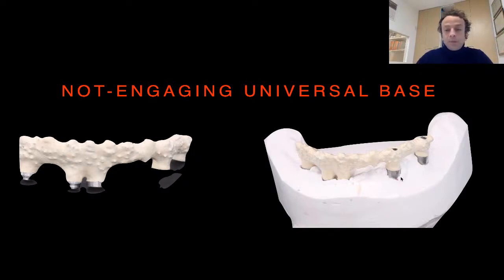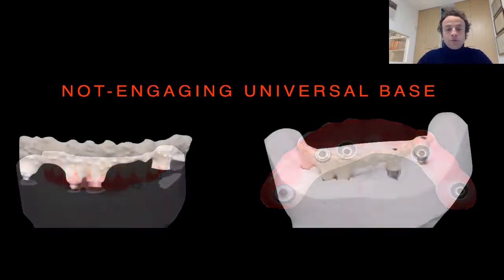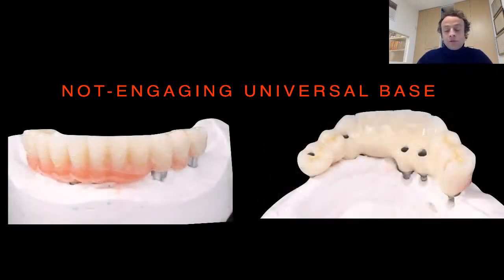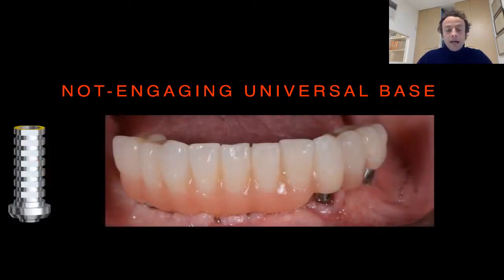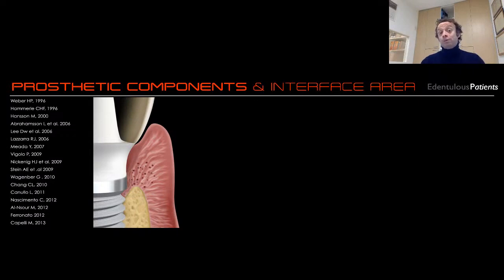Then you put the opaque, and then you prepare all the approach in order to create the acrylic reconstruction. And so after 2-3 days, you can deliver this prosthesis in the mouth. But of course, the patient has to stay for a couple of days, 3 days, without teeth.